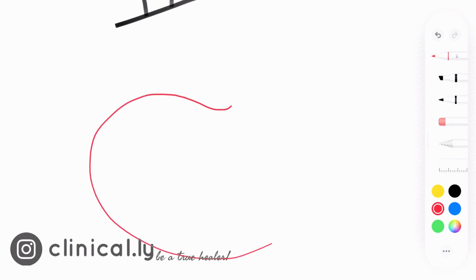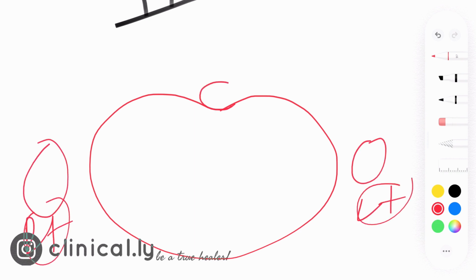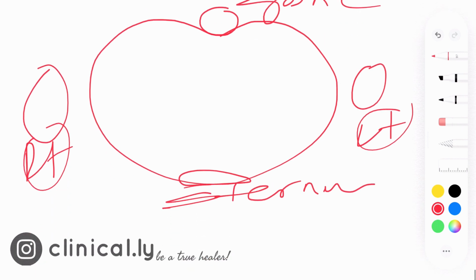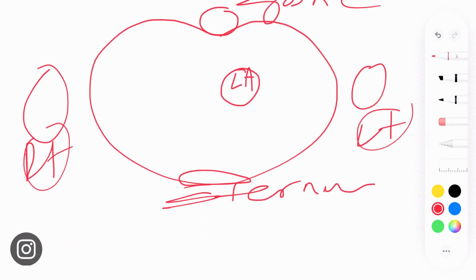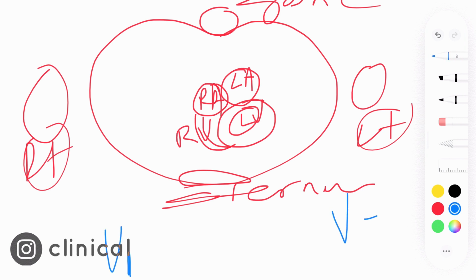For the transverse plane, let's draw the torso, the right hand, left hand, the spine and the sternum. Let's draw the cardiac chambers in an anatomical fashion. The left atrium, the right atrium, the larger left ventricle and the right ventricle wrapped around the left ventricle. Our V1 is located here and our V5 is located here. V1 looks at the heart from this direction.